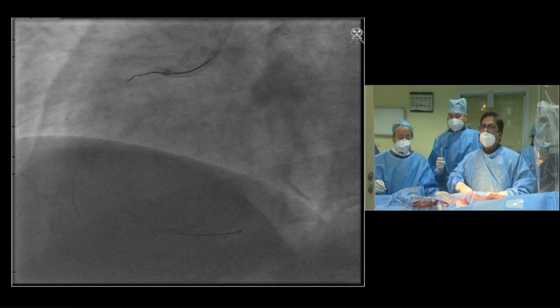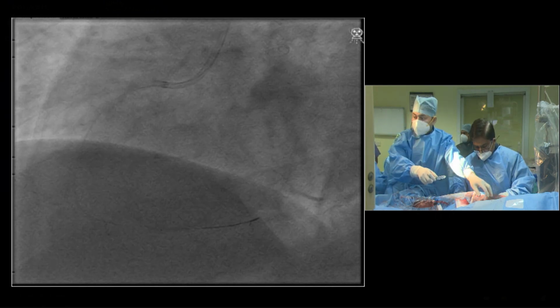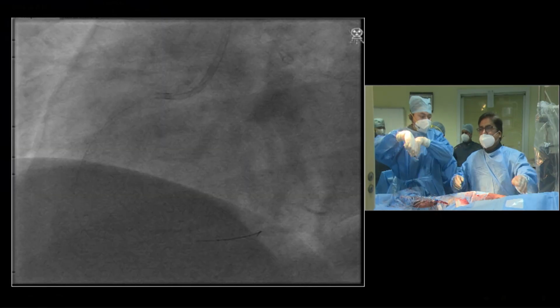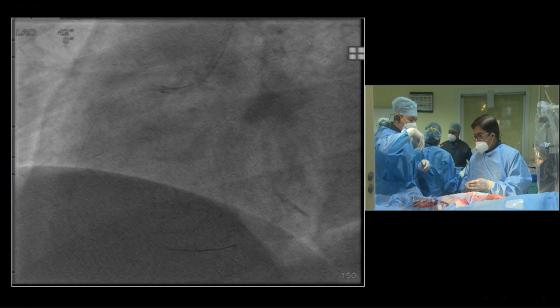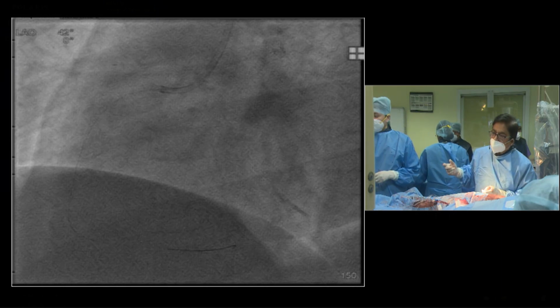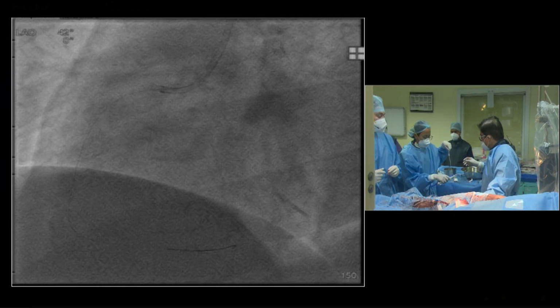Give atropine. I think some fluids and atropine is the usual way to get it up. Give me a 20 balloon. It is okay. Give me a diagnostic catheter for the left, JL 3.5. Give me a 20 balloon please. Atropine 1 ampule please. NORAD 2 mics. Start NORAD at 10 ml per hour with a single ampule.